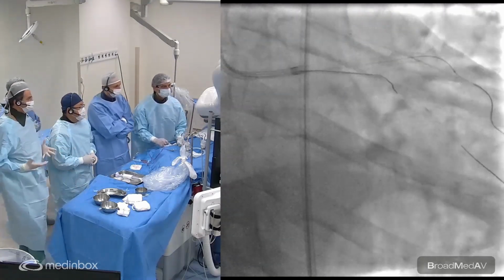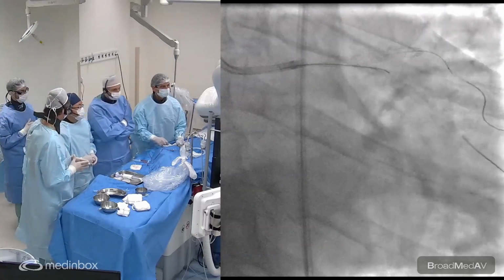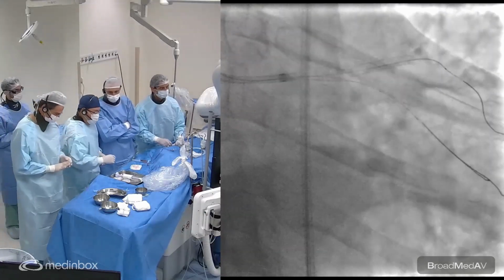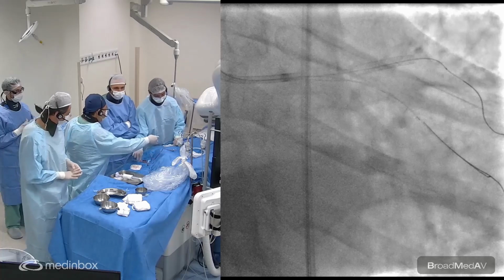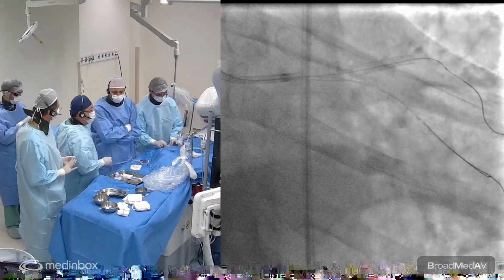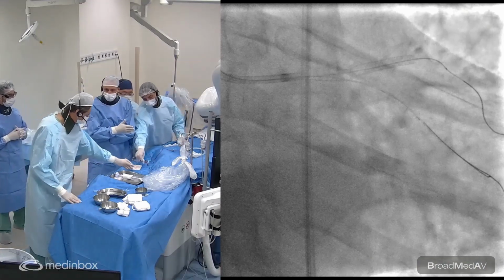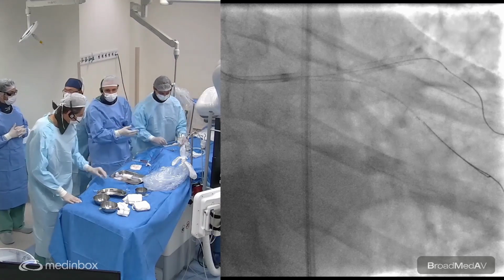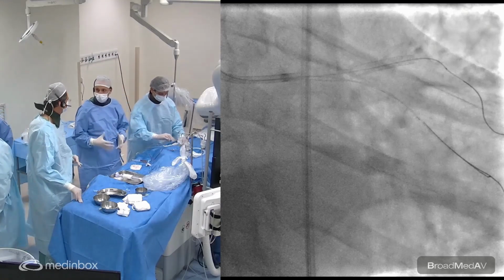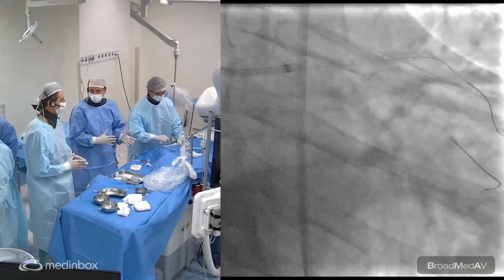Is there any study showing a difference between just leaving it alone and finalizing the procedure with a kissing balloon? Yeah, there is one study, the Nordic 3 trial, back in the 2000s, I think published 2005, 2006, that did not include left main. But what we saw there is that when you do a kissing, you're less likely to have restenosis in the side branch, though there was no significant clinical impact. We think that if you're dealing with a large side branch, and circumflex is always a large side branch, you might be preventing restenosis.